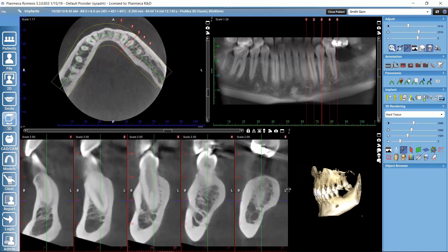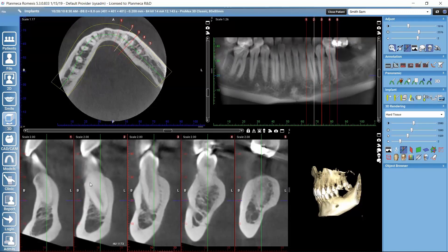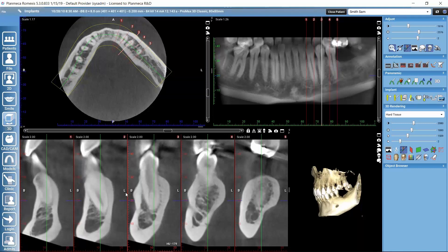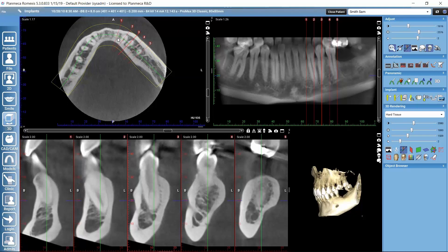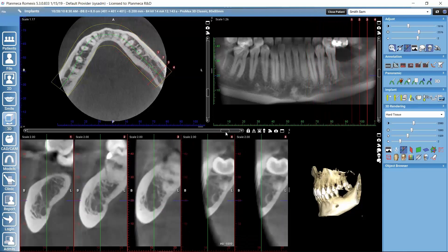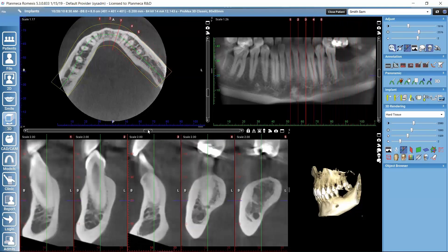Let's take a closer look at the cross-sectional slices. When I move my mouse on top of these views, I can see a color highlight showing from where that specific slice is taken. I can also see the highlight on the panoramic view on the dental arch. I can move through the cross-sectional slices along the dental arch using this slider.